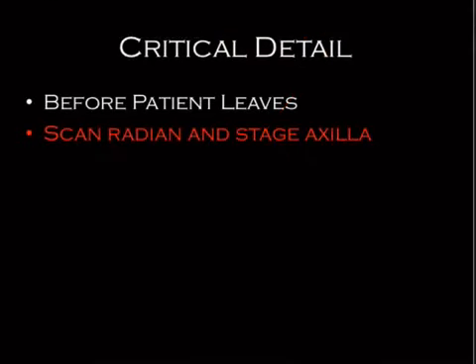Now here's a highly testable point. Before the patient leaves on that ultrasound, so if you go in there and you see that on ultrasound, and then you're confronted with a what is the next step type of question, you will want to scan the remainder of the radian. Remember, that was like that triangle of breast tissue, or the quadrant of breast tissue, and you also want to look in the axilla to see if there are abnormal lymph nodes.